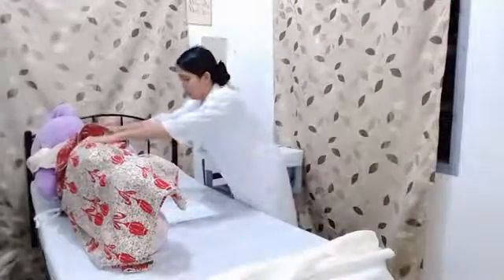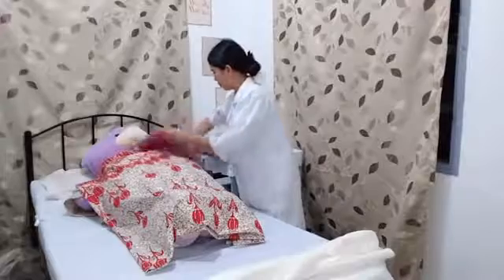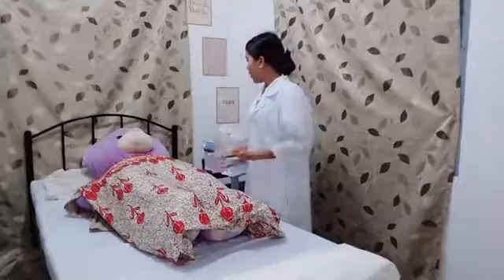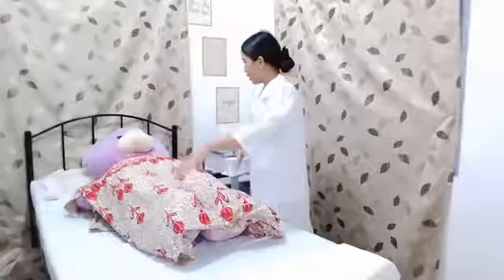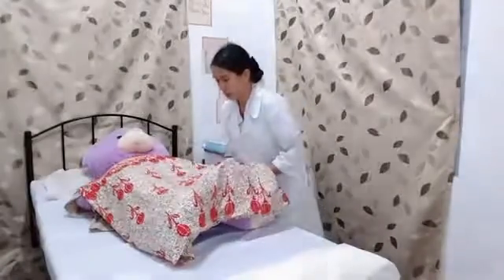Okay, you can go back now. Place the client on a supine position with feet apart and drape the client. Good visualization of the meatus is important. Embarrassment, chilliness, and tension interfere with the introduction of the catheter. Okay, Mr. Gray, right now I want you to separate your legs. Okay.